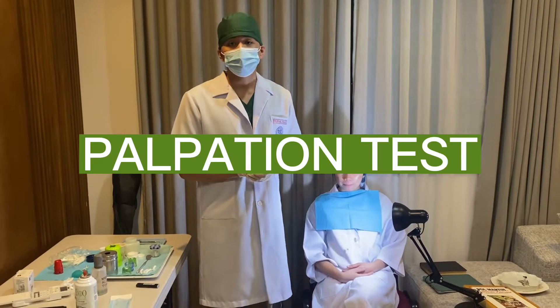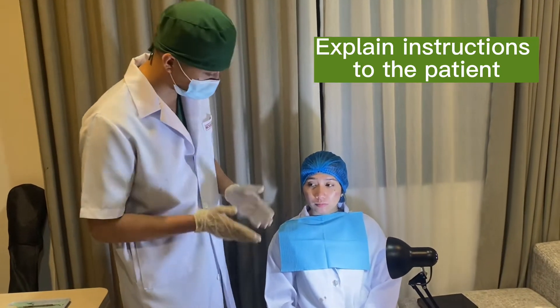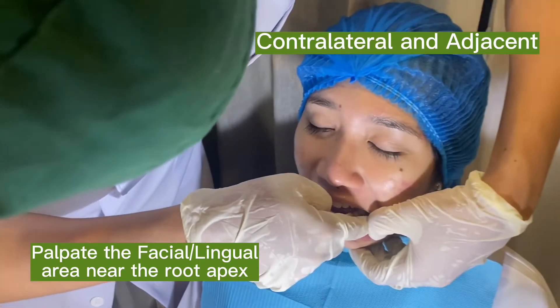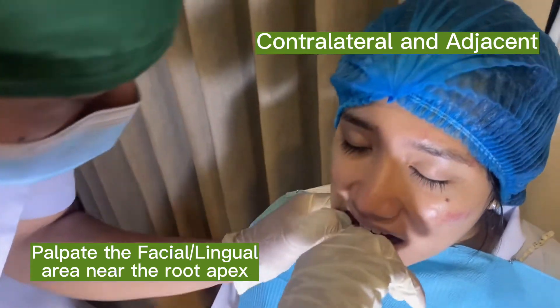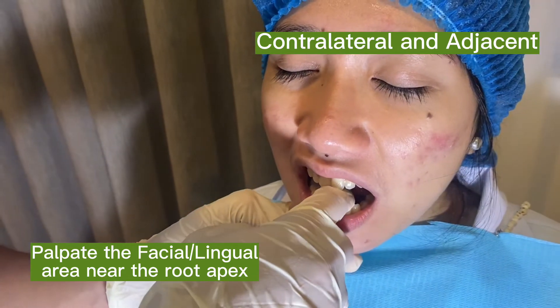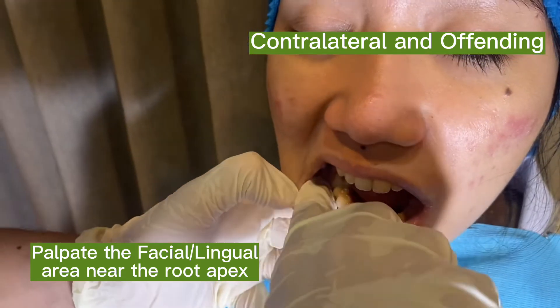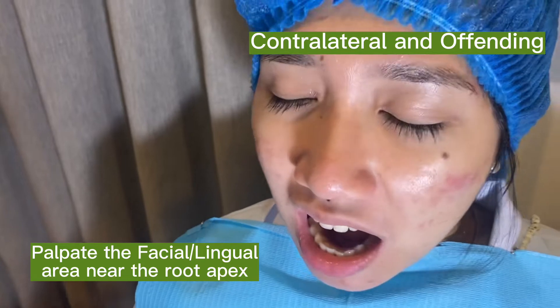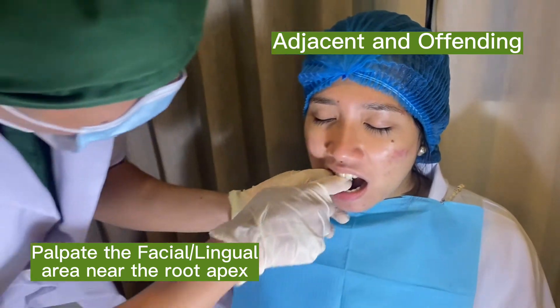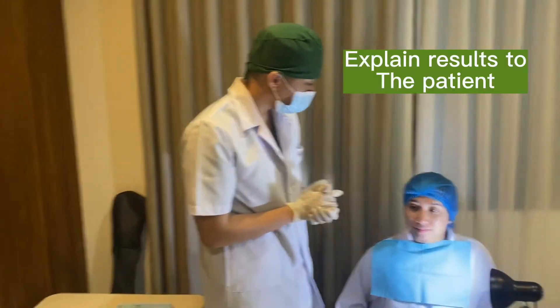The next test I will be doing is the palpation test using the index finger. I will use my index finger and palpate the area around the apex. I will assign numbers again just like in the percussion test to see if there's any difference. This is 1, this is 2. Is there any difference? Okay, so your surrounding structure seems normal. Those are normal responses.